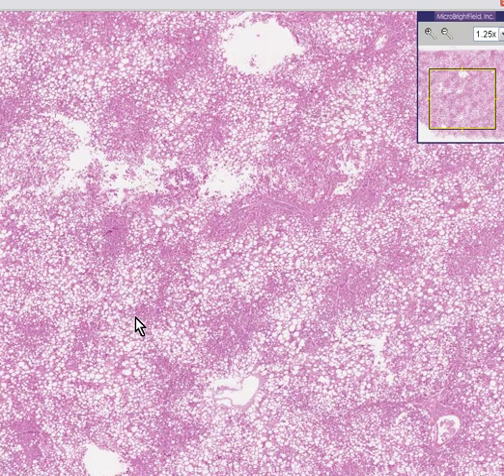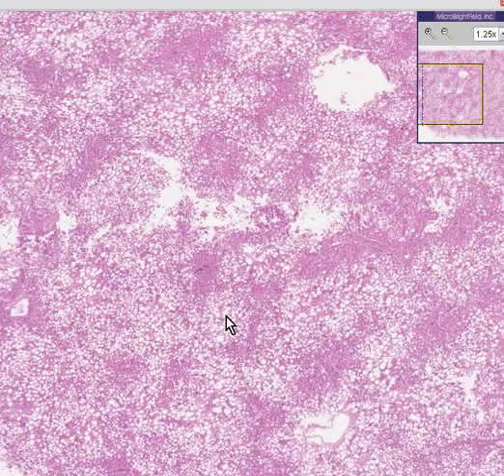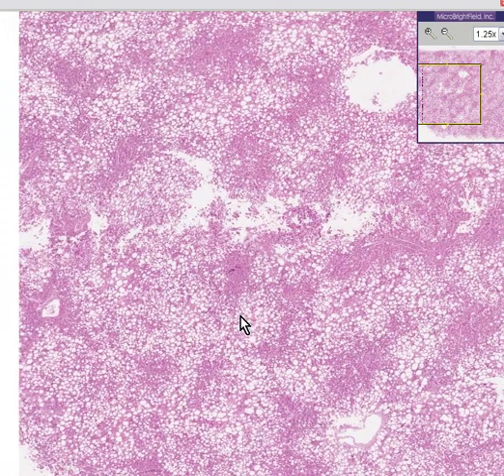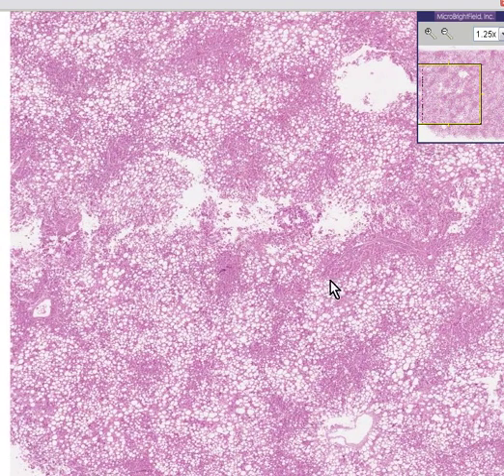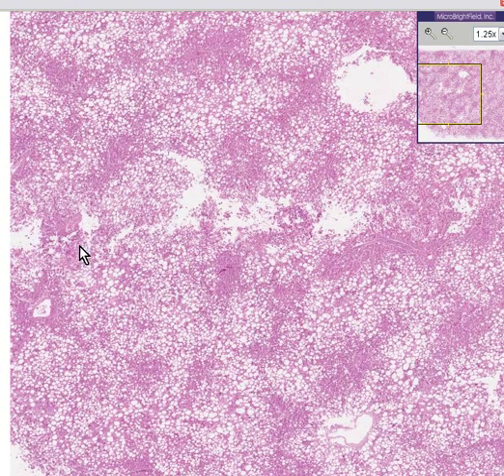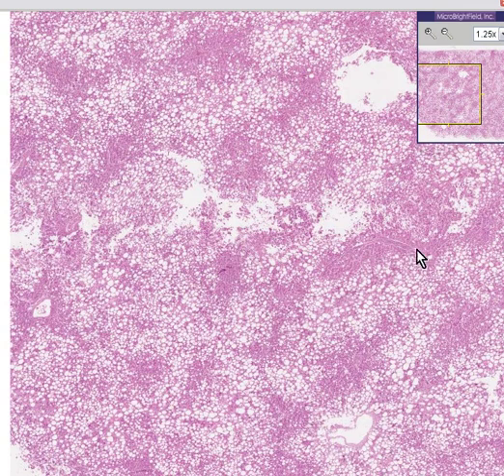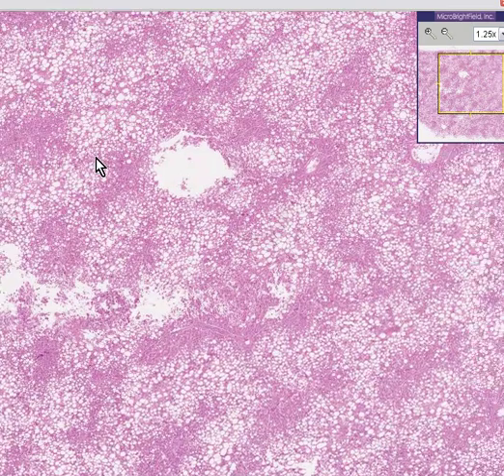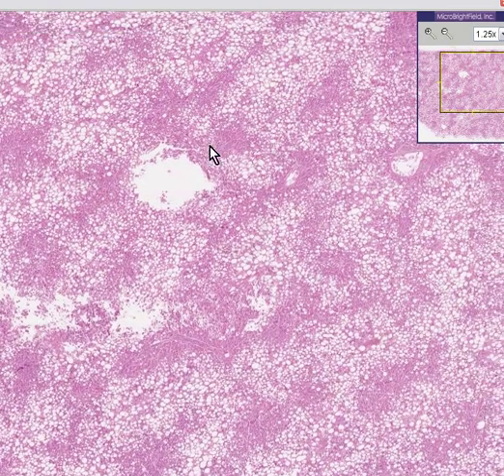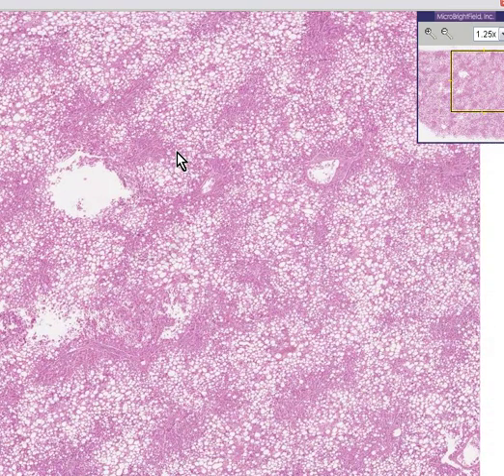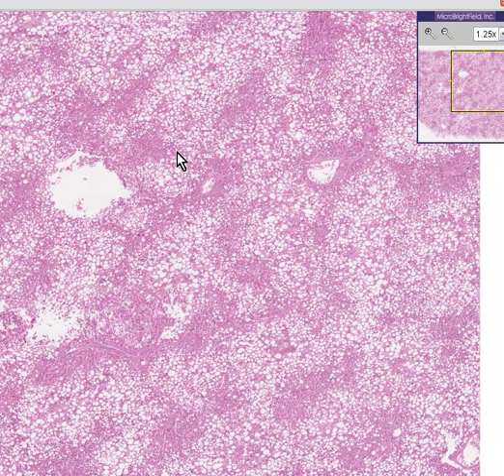But also notice that even though it's loaded with fat, that the portal areas here, here, here, here are still generally hexagonally arranged. And there's no fibrosis or nodules. So even though this is a very severe fat, it is not cirrhosis.